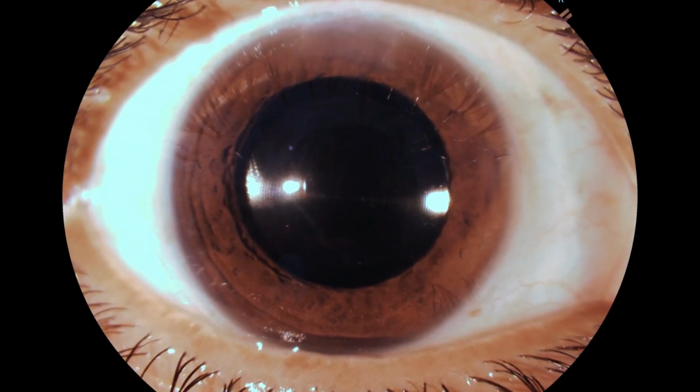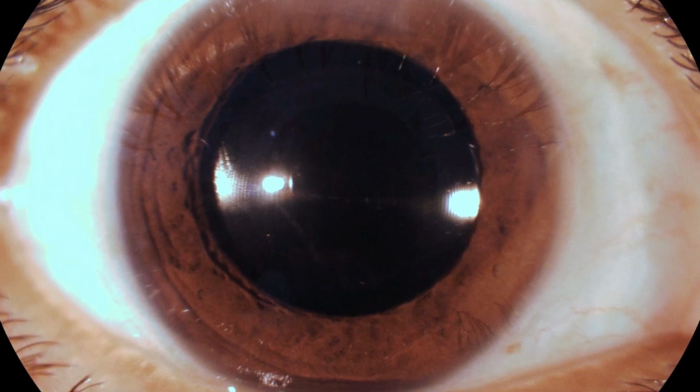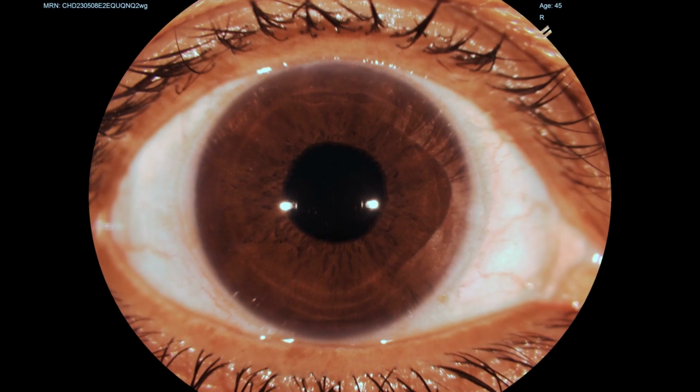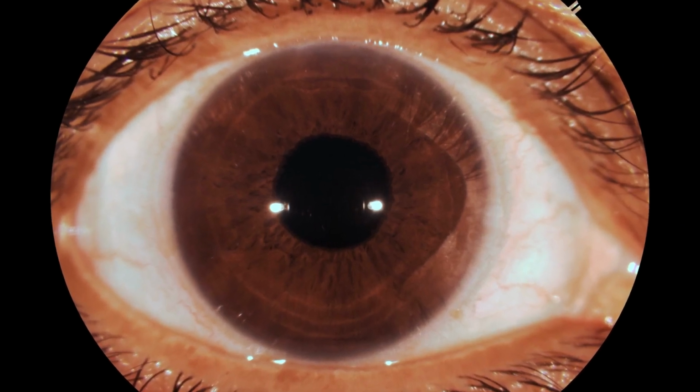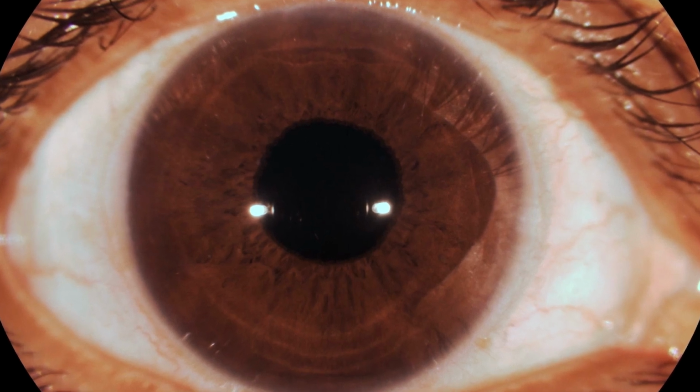This is the day 1 post-op picture. We can appreciate clear cornea, a dilated pupil and IOL which is centered. And this is the day 7 picture where the mydriatic has been stopped and the patient had good gain of vision. Thank you.